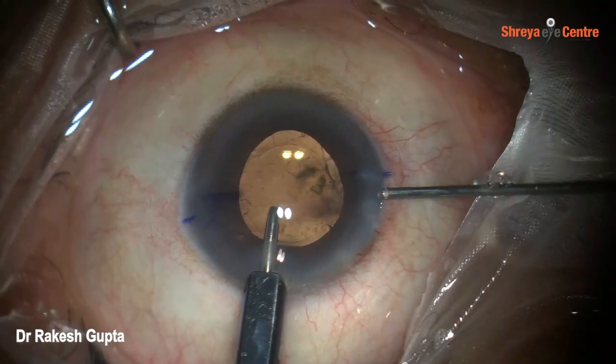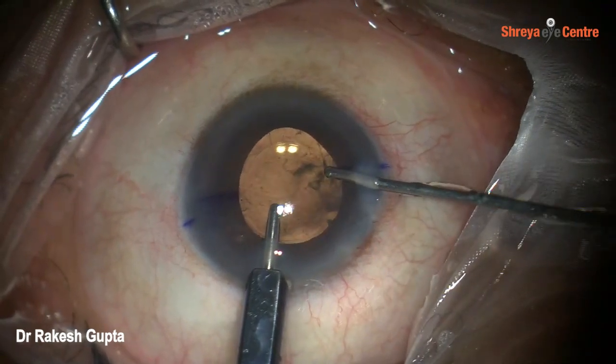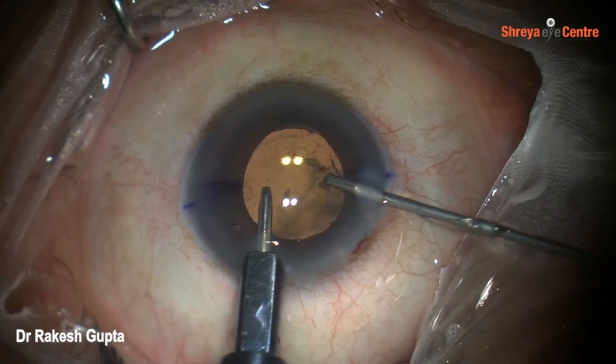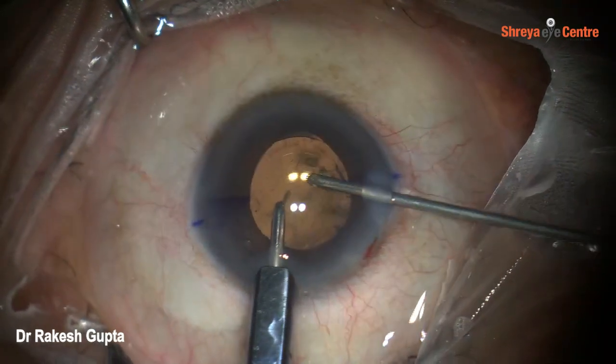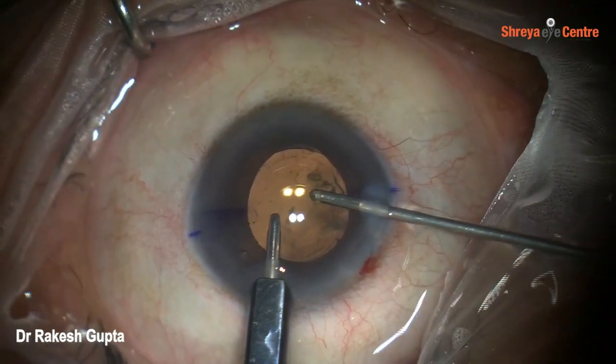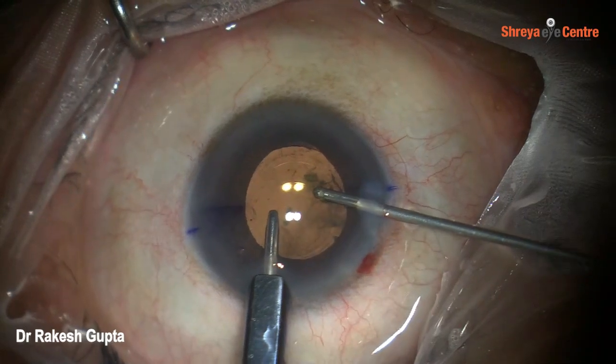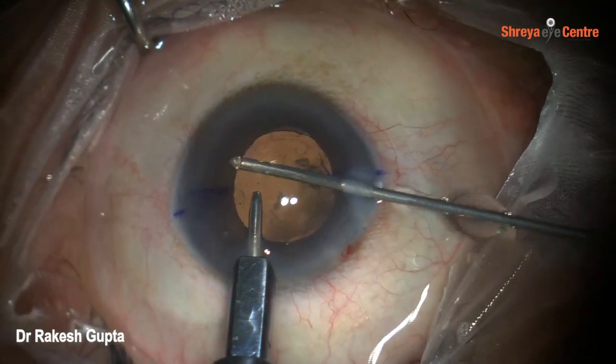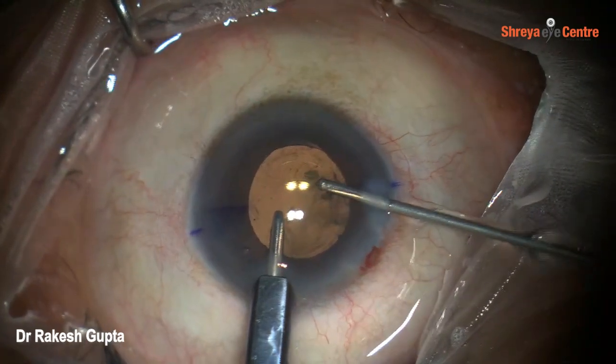Friends, though it is very clear that there is no need to do anterior vitrectomy at this stage because the lens is very well centered, and also there is no apparent vitreous in the AC, because the vitrectomy probe was made ready by my assistant, I thought let me do removal of viscoelastic by using vitrectomy, and by chance if there is any strand of vitreous, it will also be removed.